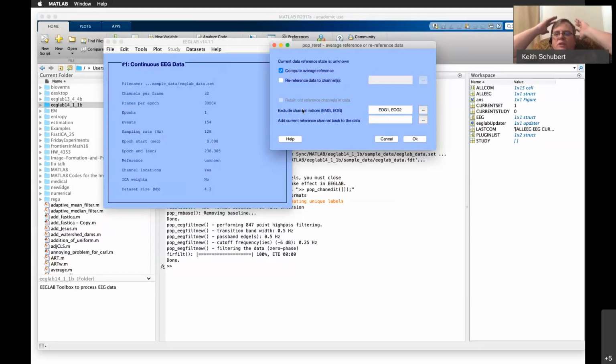If we assume that you've been just doing normal thinking, and no strange things are happening to cause electrical fields to build up, the average across the person's head should be a pretty good measure of the quiescent or middle state to reference off for brainwave activity. It is a pretty good assumption.